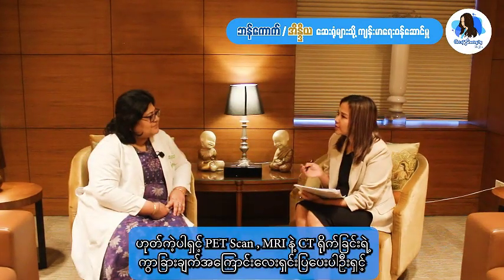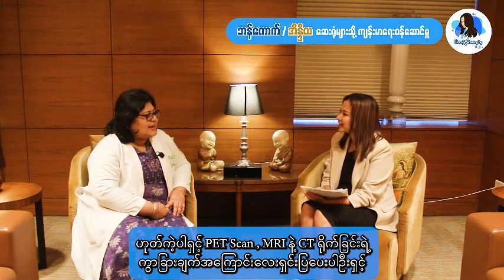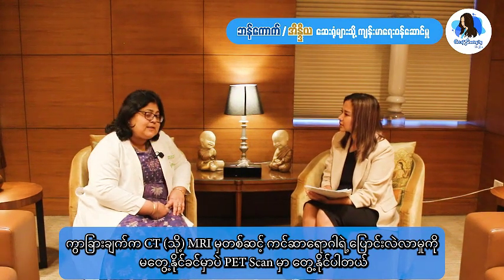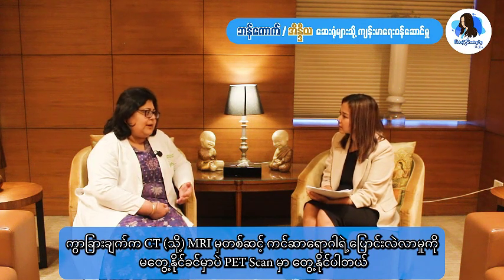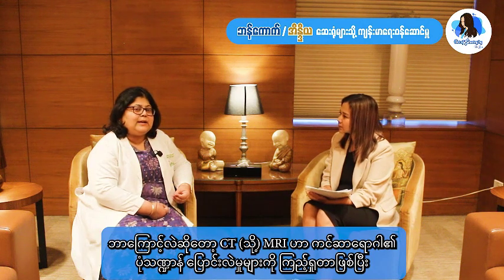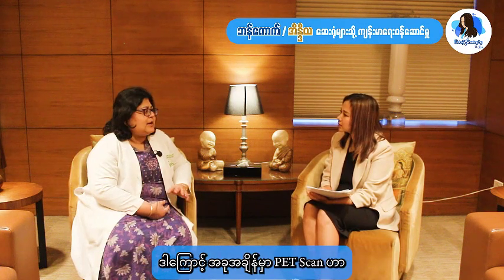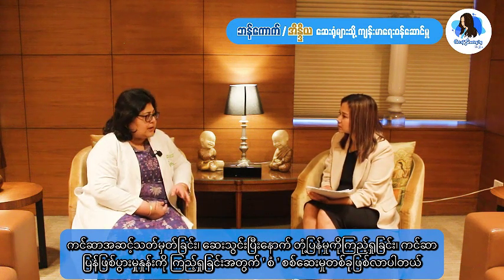Could you please explain the differences between PET scan, MRI, and CT scan? The PET scan actually detects the changes of cancer or of disease much before they are seen on a CT scan or an MRI, because PET looks at the molecular level of cancer rather than the structural level, which CT or MRI does. That is why PET CT scans are considered the standard of care for staging cancer, for assessing response, for looking for recurrence.